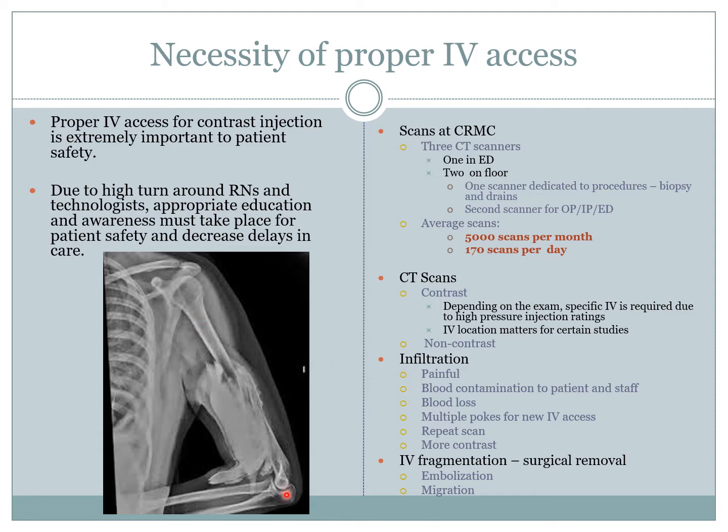Infiltration. Infiltration is, again, this picture that we have here where the arm is filled with contrast and it's not going through the body. It's very painful, as you can see. If a lot of liquid is stuck in your arm or anywhere where the IV is, that's going to be painful. It gets red, heats up, and it just bubbles. It's just like someone pushing a golf ball or something in your arm.